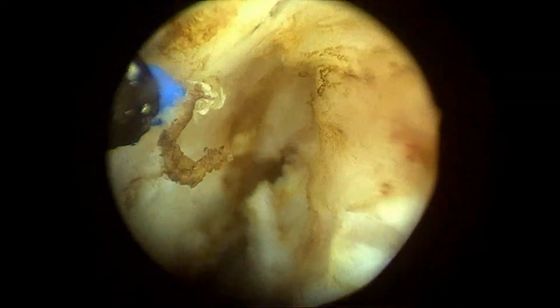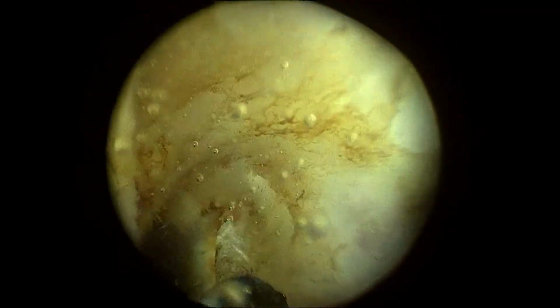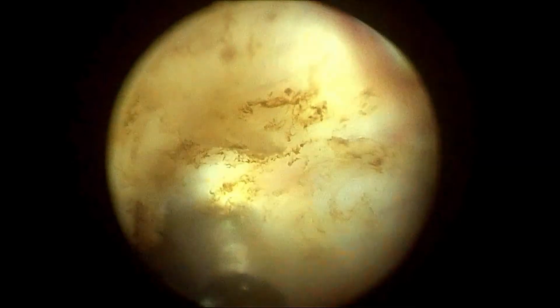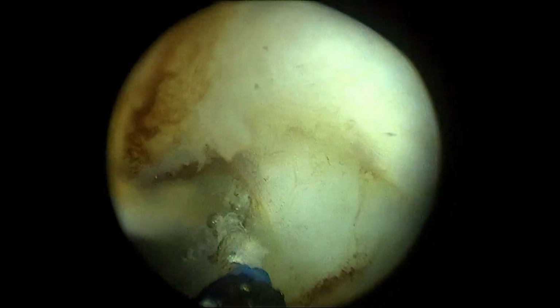Come on, that's not getting detached. Yes. So what is the incontinence rate after doing this? Sir, incontinence rate is way less, sir. Okay, way less. In my personal experience, I haven't come across somebody who is incontinent after a period of 1 month. Okay, so that is something which is really reassuring, because the only problem with Holmium was that people had incontinence.